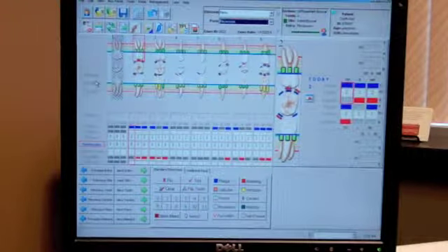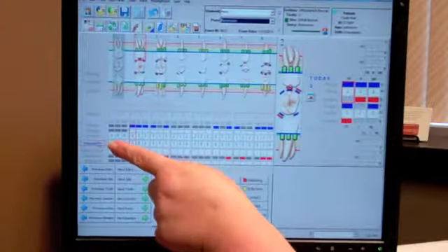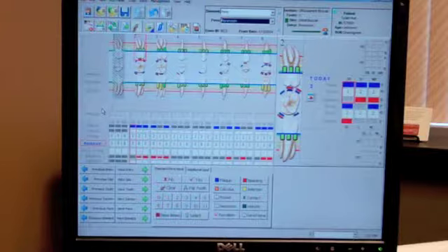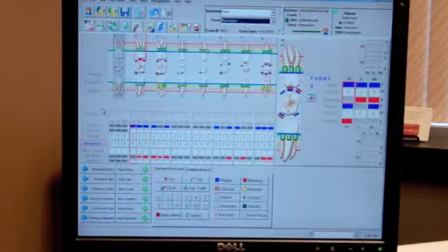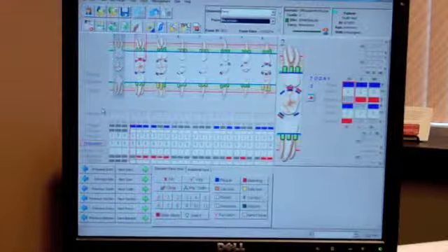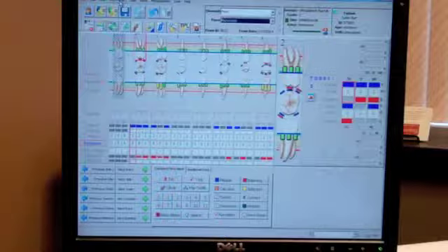If you notice here on the left-hand side, the red box will be around recession. What we do for recession right now is enter it manually. Have an assistant come in and enter it manually. So, like I said, I sit the patient up, and first I go to the aux panel.